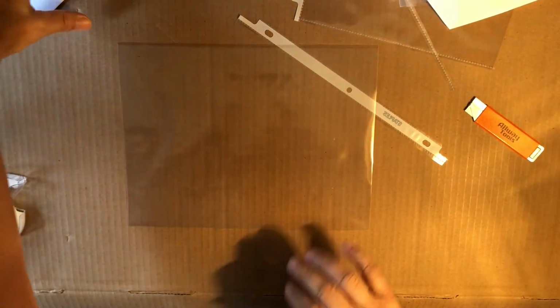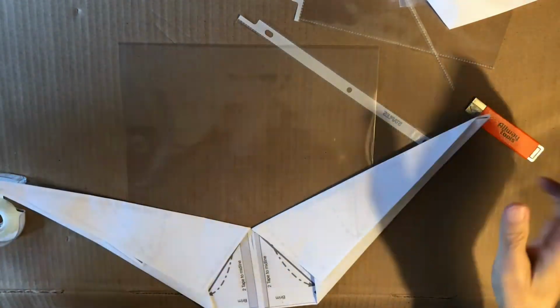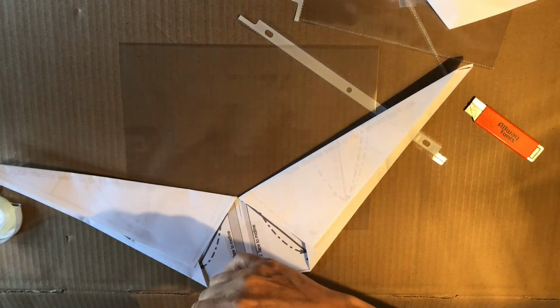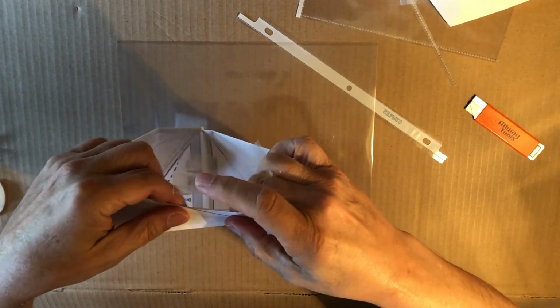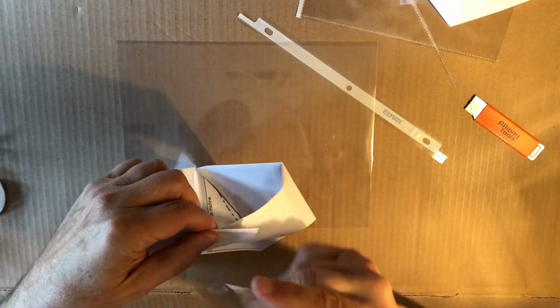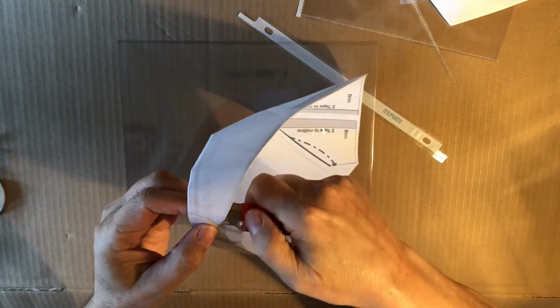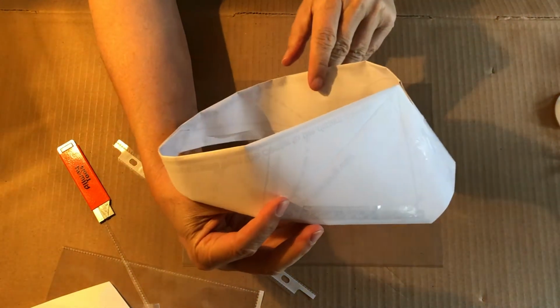Now, at this point, I think your best bet is to first close the bandana to what you think will be your head, but because it's somewhat conical, it's not critical. It will settle on your head. To do that, you should measure. I'm just gonna close this half off. So you line the straight edges up with each other. And for a fat head like me, this is about right. If you've got a skinnier head, you can have more overlap. And if you don't like this exposed tape and you're still using packing tape, you can put a little split and a little split. And there we have our hat.